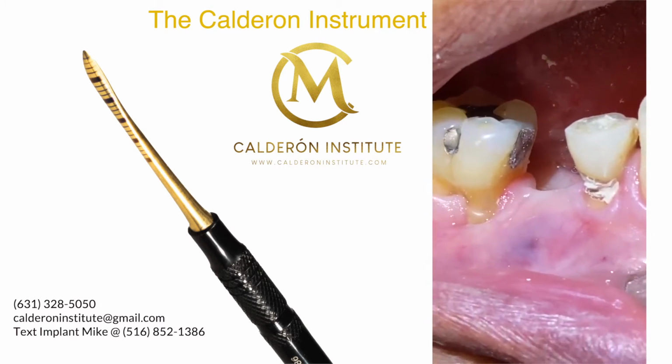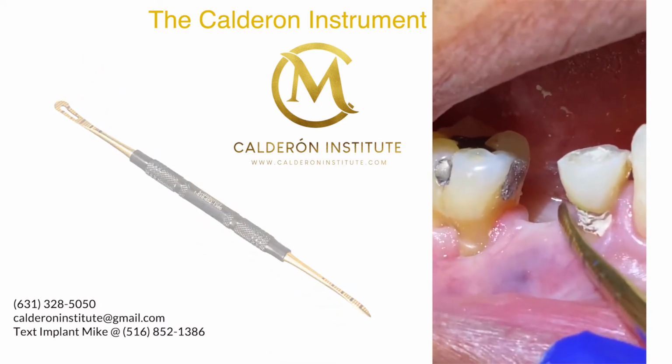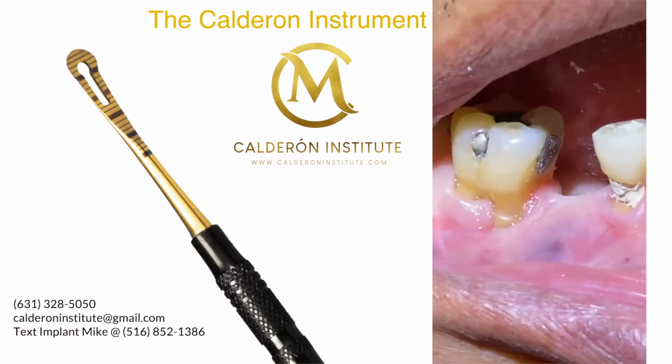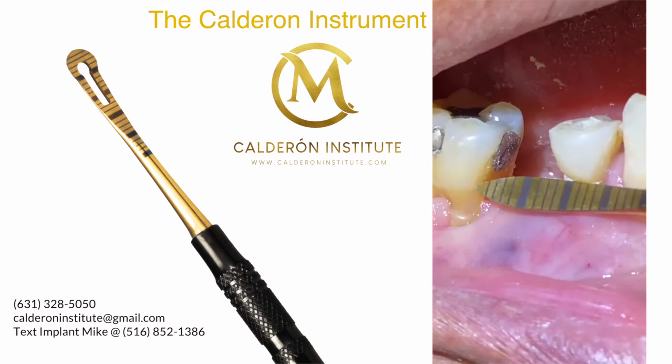But the big question is this: what is the distance from here to here? Remember, rule of 7. If you have more than 7, for every 7 millimeters you need to place one implant, according to Carl Misch. But we're going to measure the distance with the instrument.